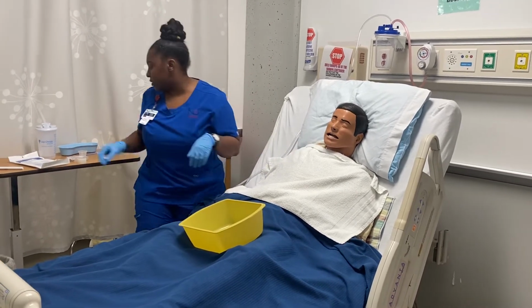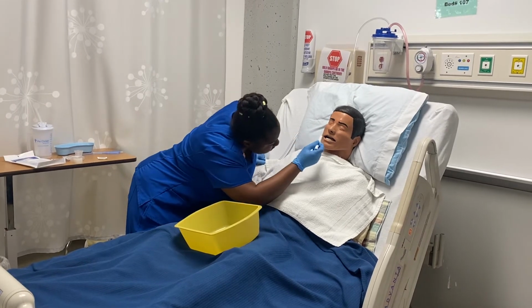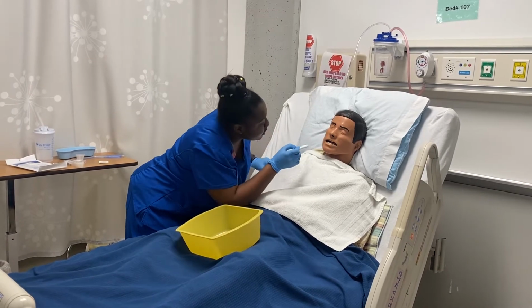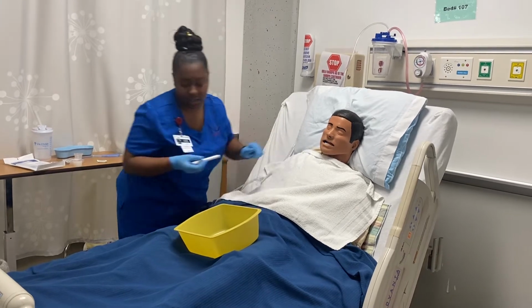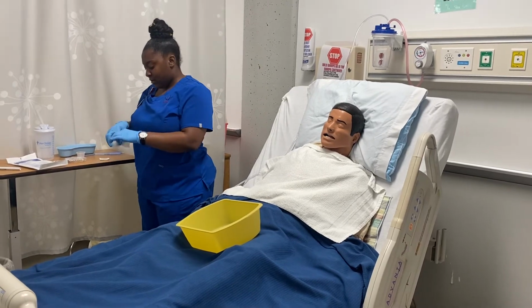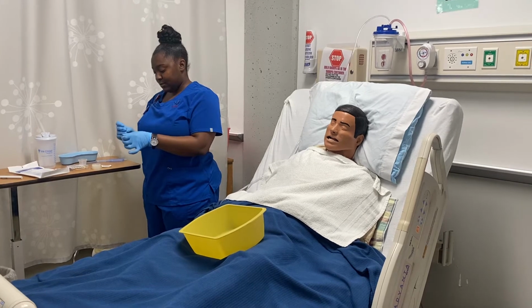Perfect. And I'm also going to check the nose to make sure there's no deviation or anything. Perfect. Thank you. Open wide. Check for any lesions in the mouth or anything like that. Perfect. Okay, so now we're going to get started. I'm going to prepare my tape for when the NG tube is out.